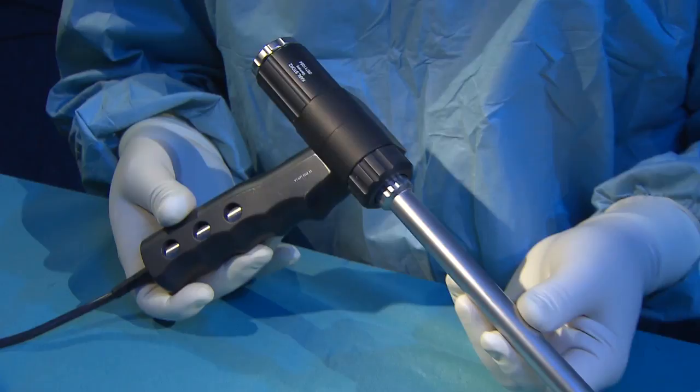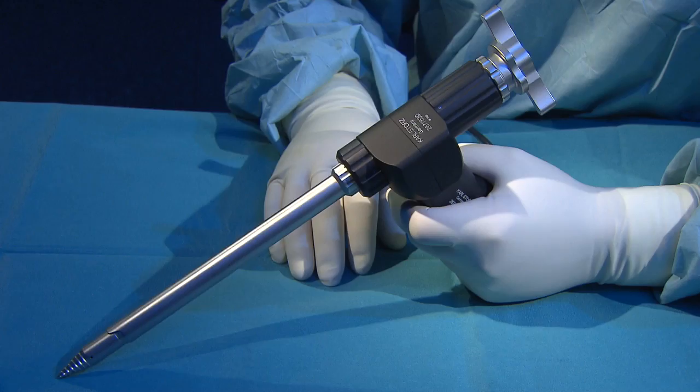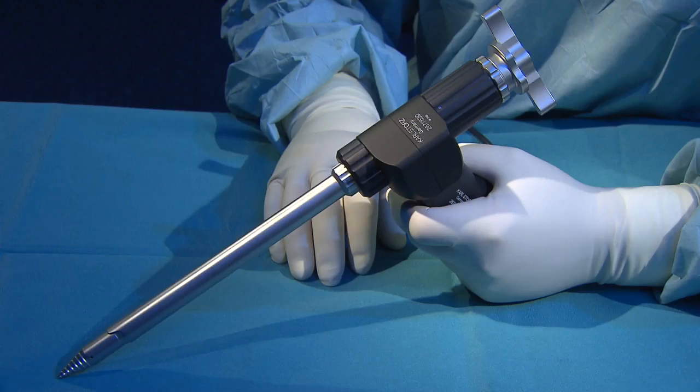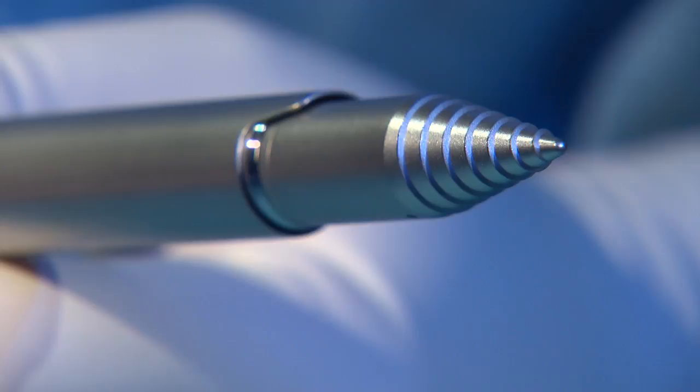The rotatable trocar is now inserted into the morcellator. The latter is then complete and ready for use. The ergonomic handle gives the surgeon a stable, secure grip on the morcellator.